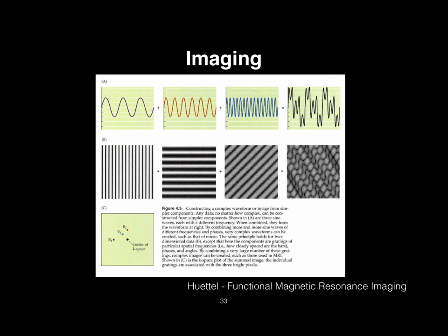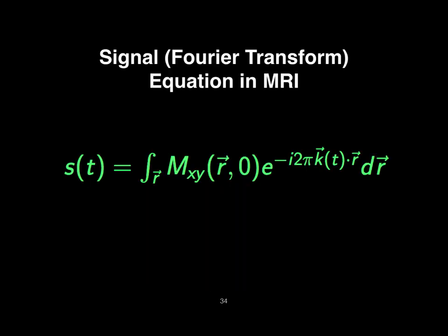People familiar with graphic equalizers, audio equalizers at all? You can essentially bring out different aspects of the music depending on its frequency. If you want your bass, you bring up your lower frequencies. If you want more treble, higher frequencies. So it's a very similar idea, where whatever waveform you're trying to recreate, you're balancing how much of each frequency you have to add to give you back your image. And that's all formalized in this equation, which is the Fourier transform.